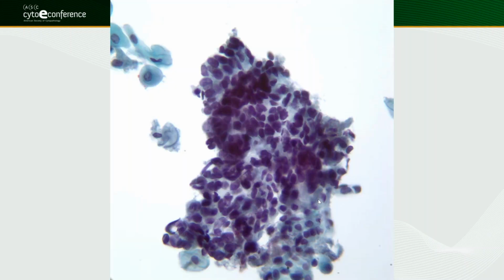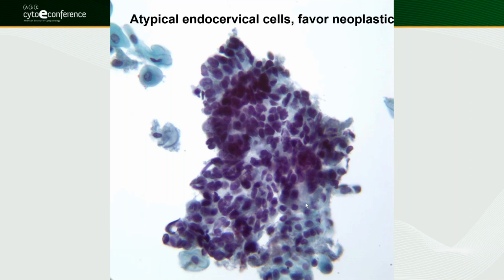And another one, and this is more towards pushing it. It's again very columnar cells, elongated cells with hyperchromatic nuclei and high NC ratio and very crowded structure. And you can imagine some maybe secondary acinar architecture here. So definitely atypical favor neoplastic. And another one showing similar, I mean, this is definitely kind of a glandular structure here with crowded and hyperchromatic groups with elongated nuclei.